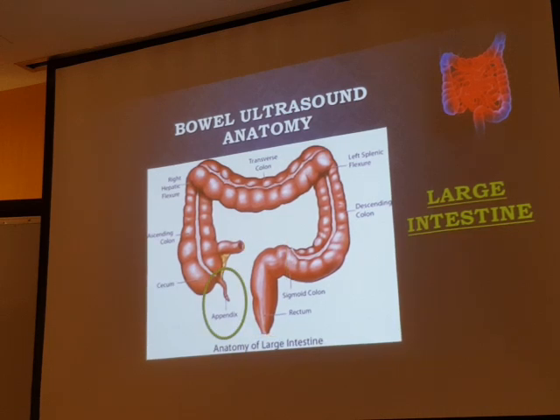These are the several parts of the examination. We have to assess it, we have to evaluate it. When the exam is a bowel ultrasound, this part should be included. In your exam, each segment should be included, to say it's normal or abnormal. Except pyloric stenosis, it's a separate examination, needs different preparation, and a different dynamic examination.